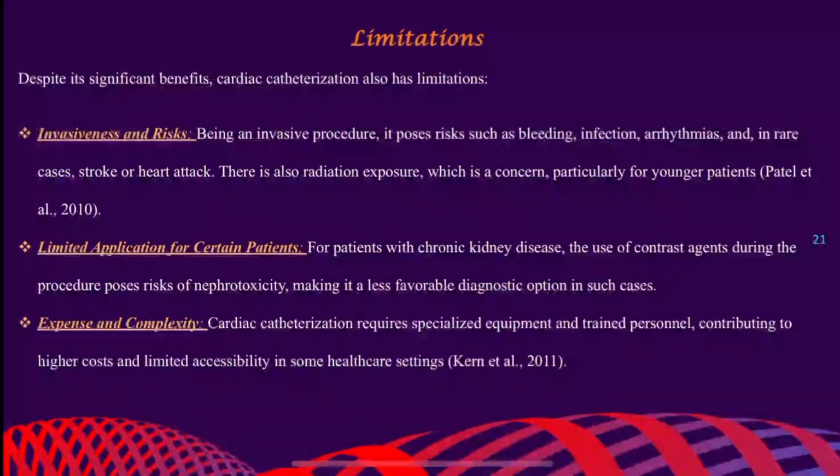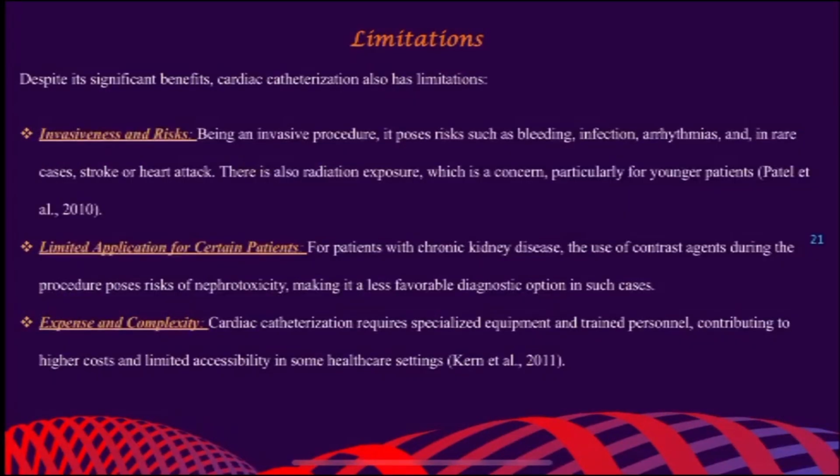Limited application for certain patients. For patients with chronic kidney disease, the use of contrast agents during the procedure poses risk of nephrotoxicity, making it a less favorable diagnostic option in such cases. Expense and complexity. Cardiac catheterization requires specialized equipment and trained personnel, contributing to higher cost and limited accessibility in some healthcare settings.